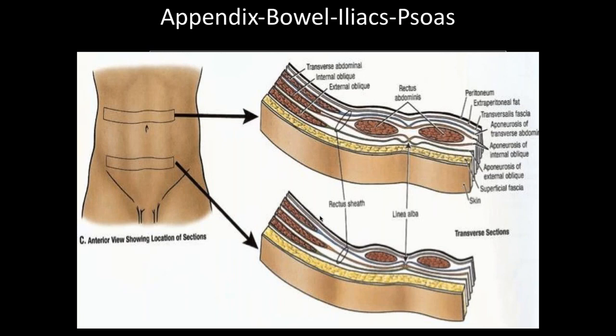And then before we move on to the ultrasound clips in this presentation, I want to go through one last anatomical image because it's relevant to what we're looking at on the ultrasound screen. This is a cross section taken out in the high yield area, and I want to go through the layers that we're going to see.